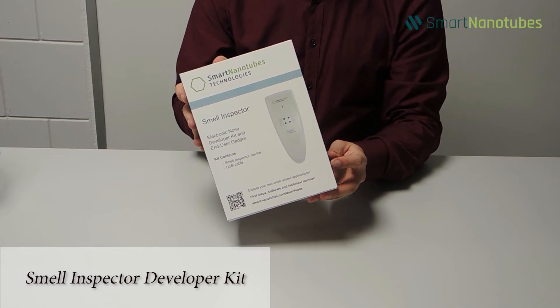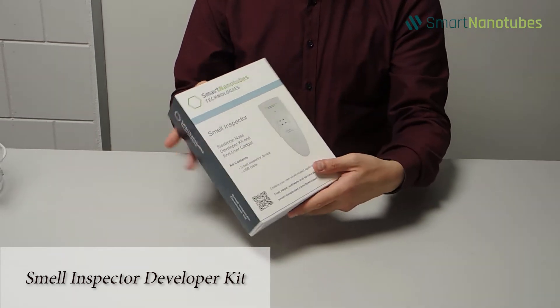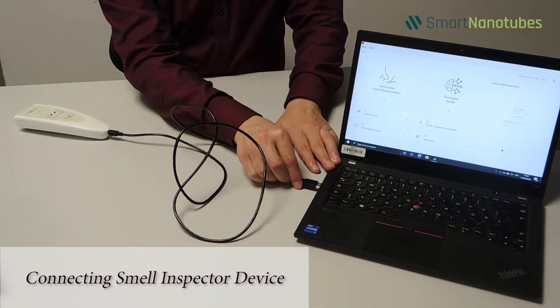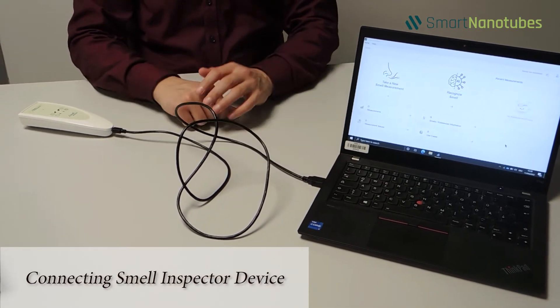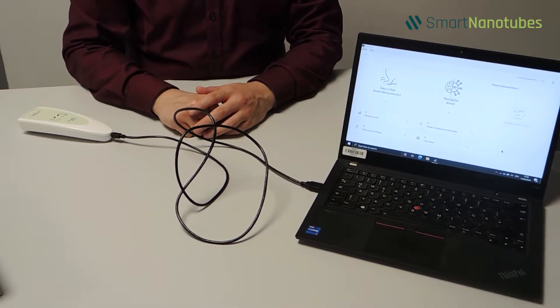Welcome to the Smell Inspector Developer Kit Video Guide. Now connect the device to the computer via USB or the mobile app via Bluetooth.